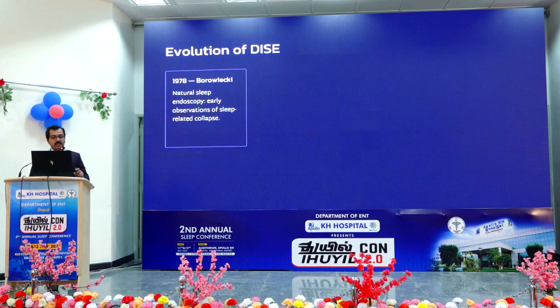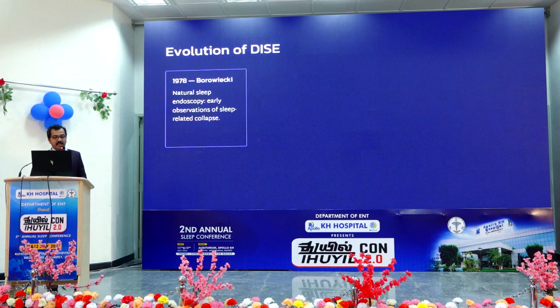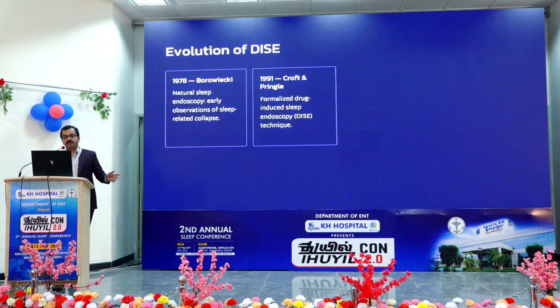Now, the evolution of DISE. In 1978, Borowiecki et al. first proposed natural sleep endoscopy, where an endoscopy was done when the patient was naturally asleep. But it needs a lot of resources, time and patience, and only one patient can be endoscoped on a single day. Later, in 1991, Croft and Pringle formalized drug-induced endoscopy, where they gave pharmacological agents, sedated the patient, and did the endoscopy at the same time.